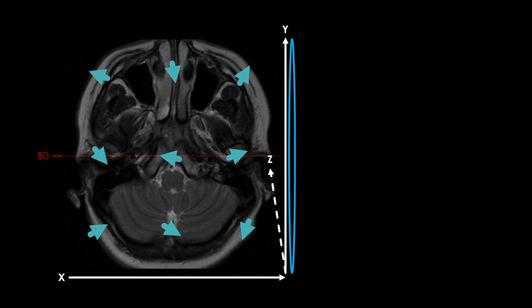So is it really that simple? We just apply a large flip angle on our second RF pulse and magically get an echo? What's really going on here? To understand this, we need to put ourselves in the perspective of the receiver coils and ask ourselves, what do the coils see?